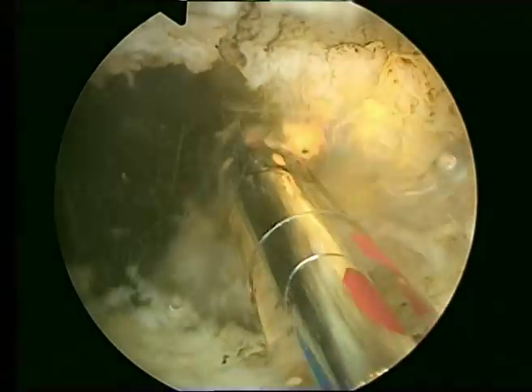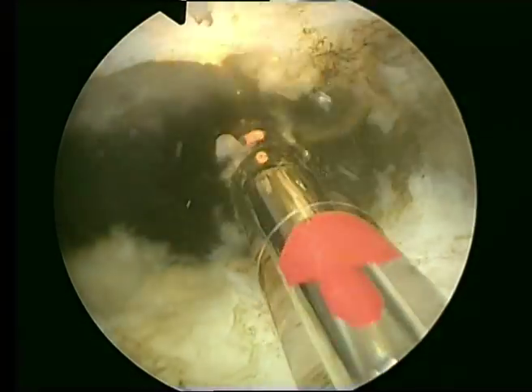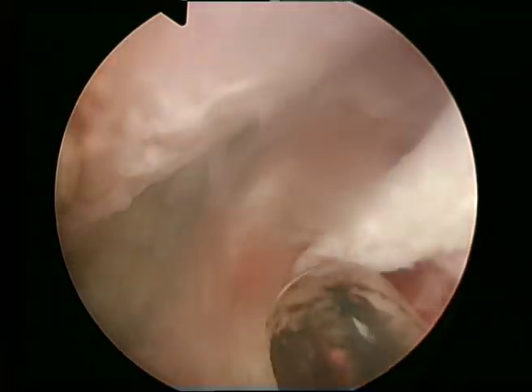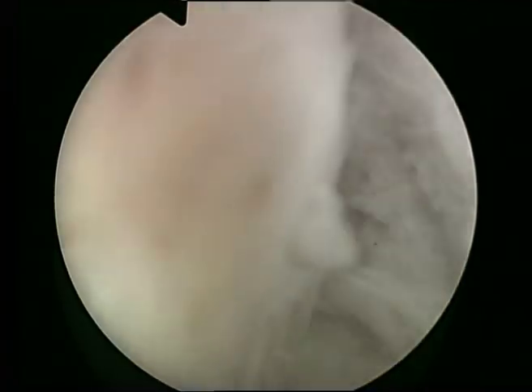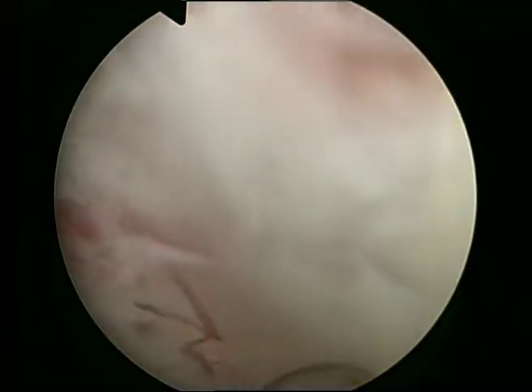I didn't realize the bladder neck and adenoma were separate structures until I started doing enucleations — you can see very clearly they are separate structures. I'm using 80 watts and rotating the fiber very fast to achieve good hemostasis, and it's important to spend the time doing hemostasis. Here we go to the other side — always stopping for hemostasis is not a problem, it's usually what you have to do. Now the capsule would be on the right side of the image and the adenoma would be on the left, and I am trying to get up anteriorly to find the bladder neck as we did on the other side.